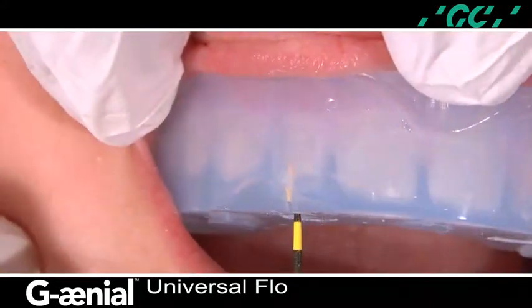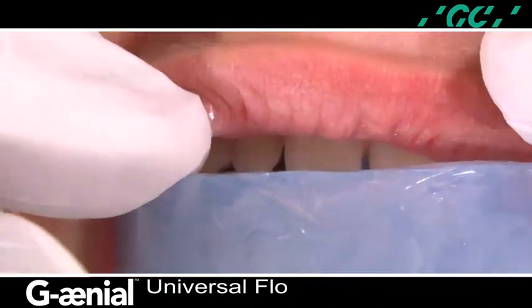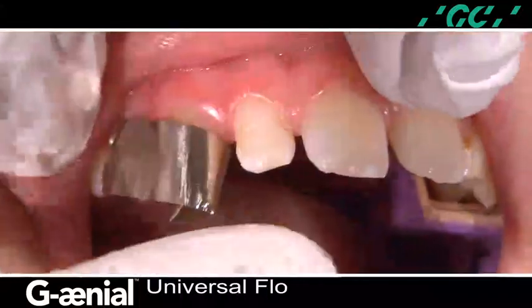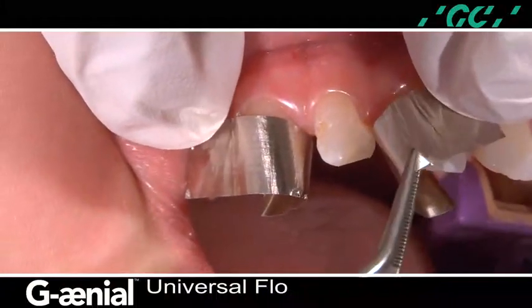A final rehearsal is done to ensure a precise placement of the silicone matrix and the correct path of insertion of the syringe tip prior to the restorative procedure. Before adhesive surface preparation, each tooth is separated by applying a dead metal matrix, Teflon tape, or using the proximal adaptation technique with a small amount of glycerin on the adjacent teeth.